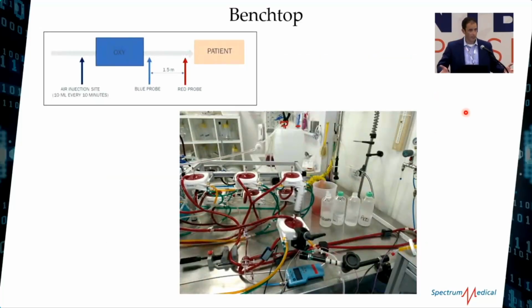And in looking at some of the studies, so we could look at what kind of impact this is, and also how our oxygenators were going to perform, not just in a hypobaric state, but under regular circumstances, we did a lot of bench work blowing a lot of air into the circuits and introducing that air so we could see how much impact we could have on mitigating gaseous microemboli.